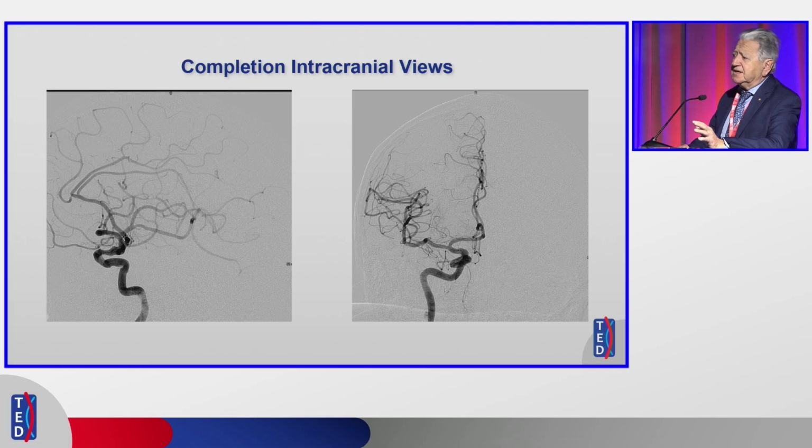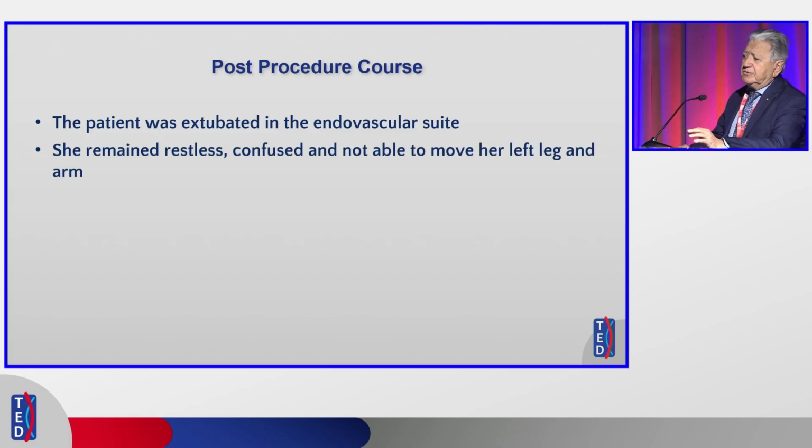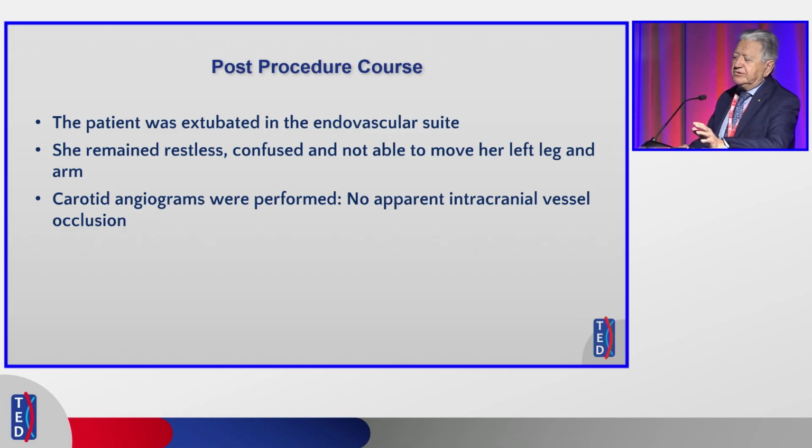The patient was intubated under general anesthesia, and we performed the intracranial angiogram. We didn't see anything new. We did a pre and post, and they look exactly the same. So we said, well, no harm is done. But when the patient was extubated in the endovascular suite, she was extremely restless, confused, combative, and was not able to move her left leg and left arm. So we knew there was some trouble there.